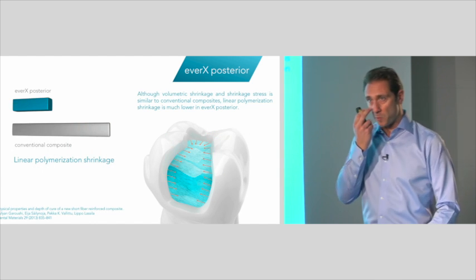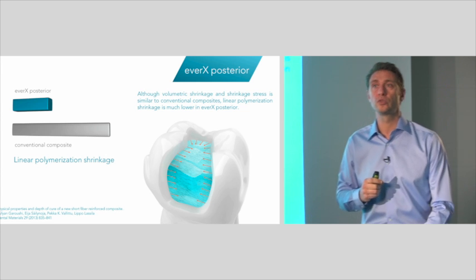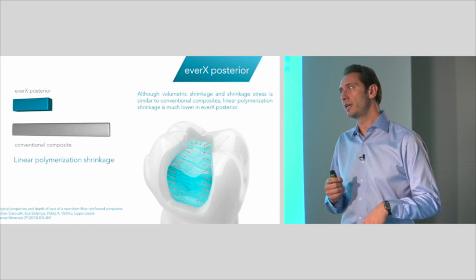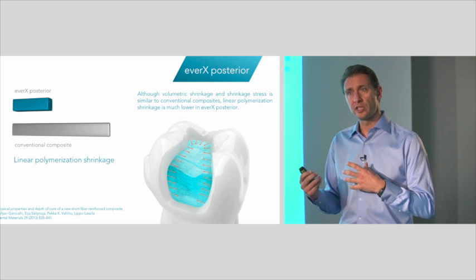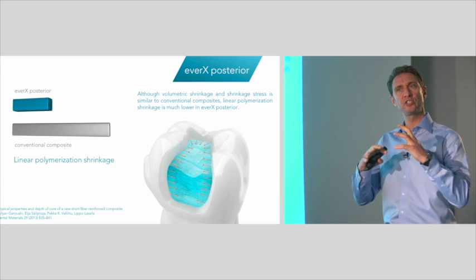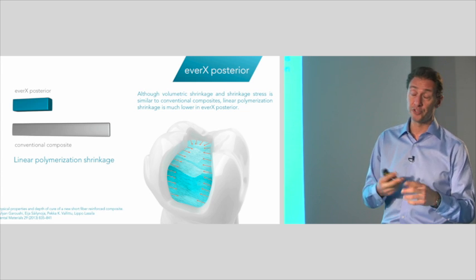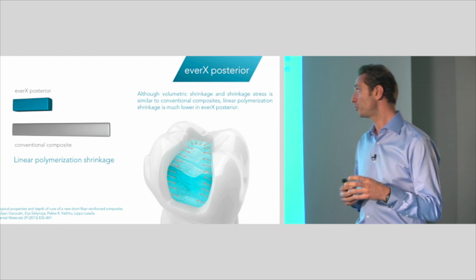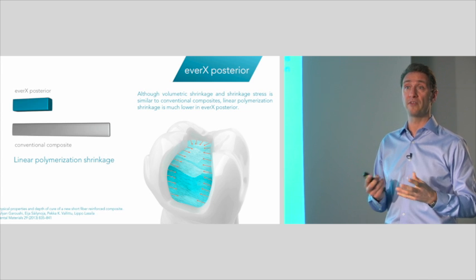Something very important, I think this is critical, especially in relation to how the handling of the material and the build-up procedure will still allow a good functioning complex, is the way the material shrinks. And let's be honest, the volumetric change of the material during and after setting, and the shrinkage stress, is pretty similar to regular composite. But a very big difference is the presence of the fibers.